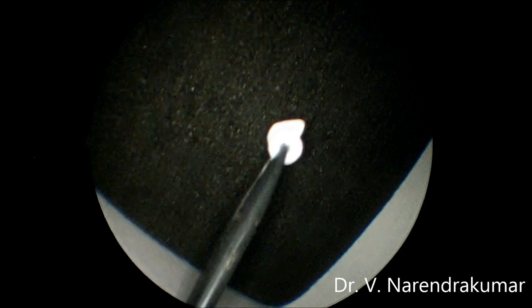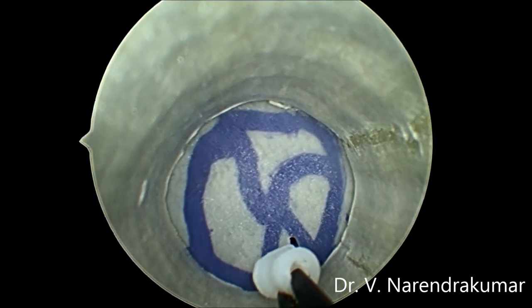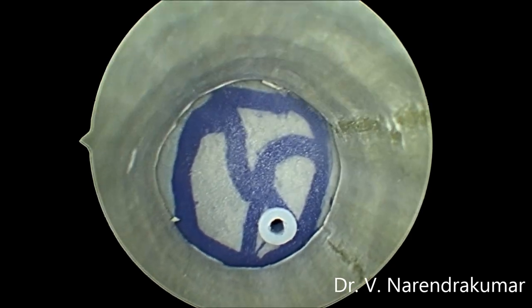Just hold the grommet and go in. Insert the grommet in a sliding oblique manner. Yes, that's it — very simple. You can make the same in multiple attempts too.